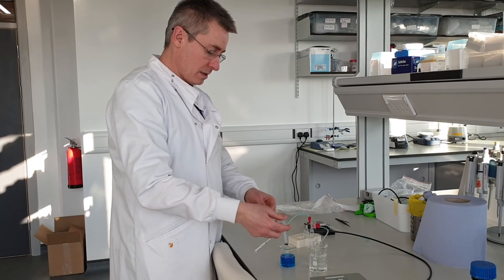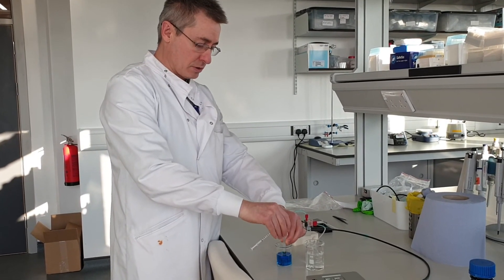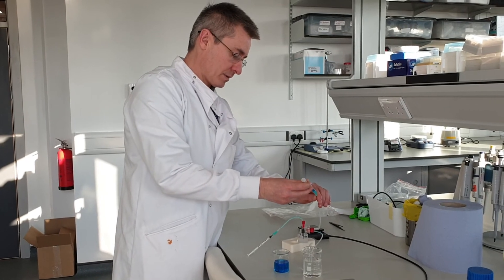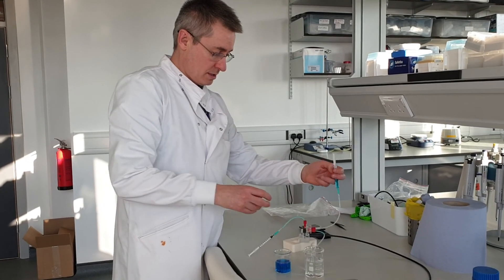Then what it will do is prompt you to do a second injection, and I come in to complete that step.